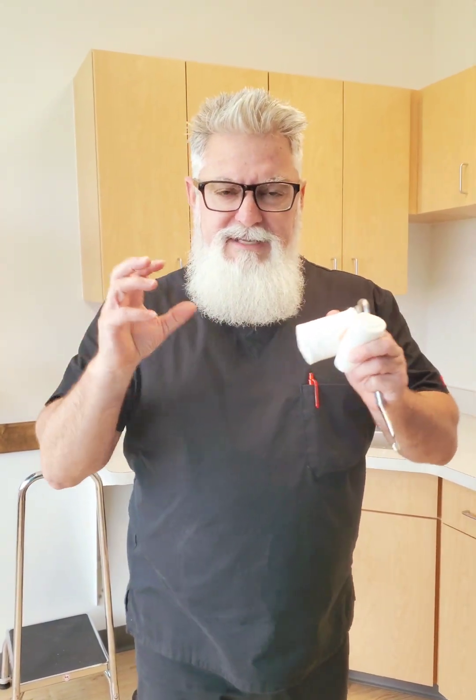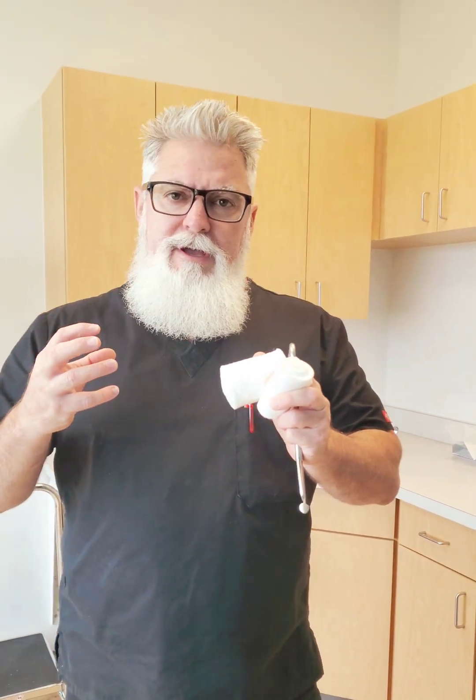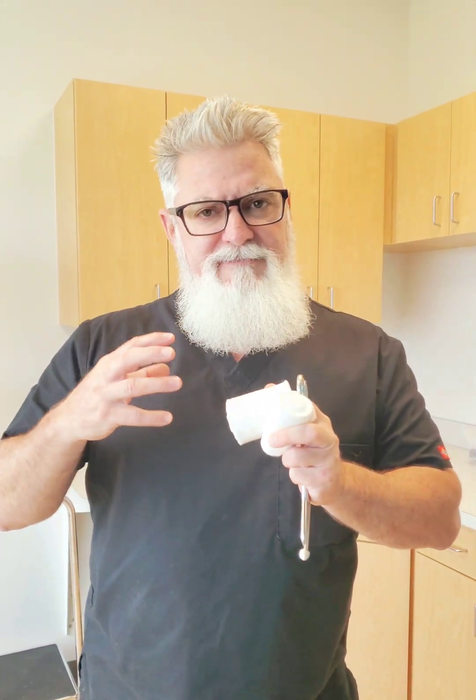Hey you guys, Woody here. Thanks for joining us again. If you've been staying in tune with us for the last short while, you know that we're making a series of videos — specifically requested videos on how to do a cast with a mold.